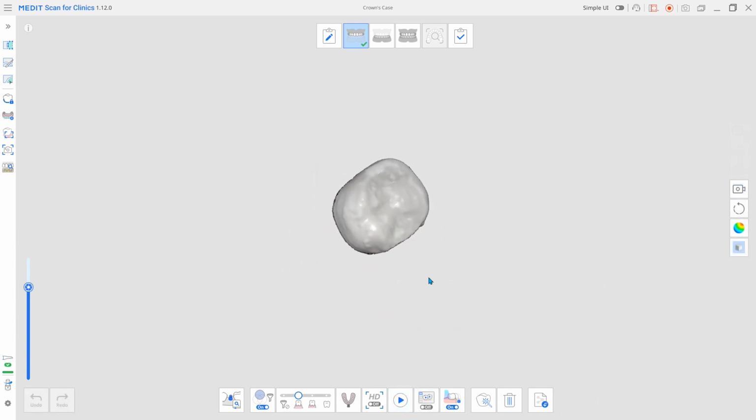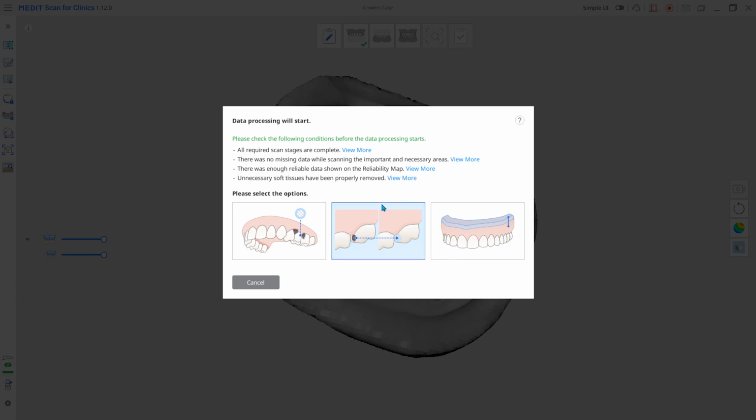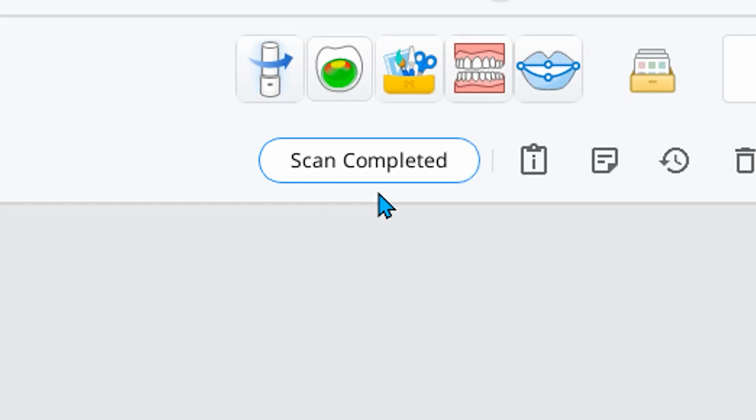Scanning is complete. Click Complete to save the scan data. Post-processing is complete.